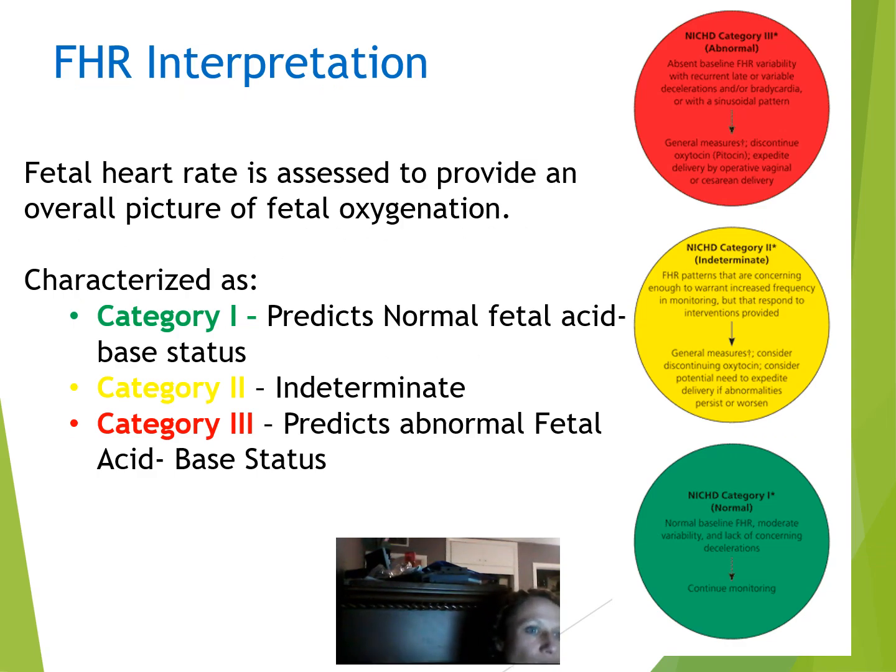Okay, so fetal heart rate assessment. I see my video separated this, so I might try to fix that before you see this slide. But fetal heart rate assessment, we actually define in 3 different categories. I know that sounds like, oh my gosh, I have to learn 3 categories, but it's actually quite easy, I promise you. Do you remember we talked about how moderate variability is the best?